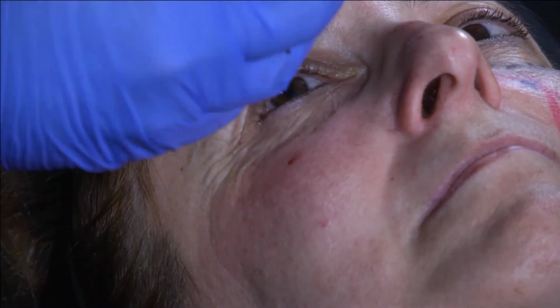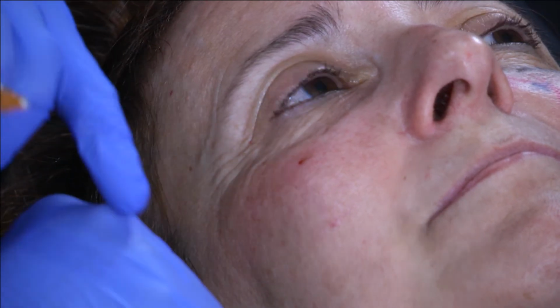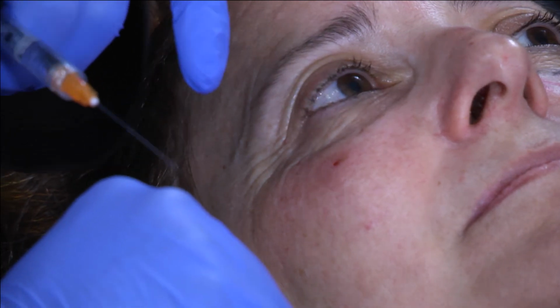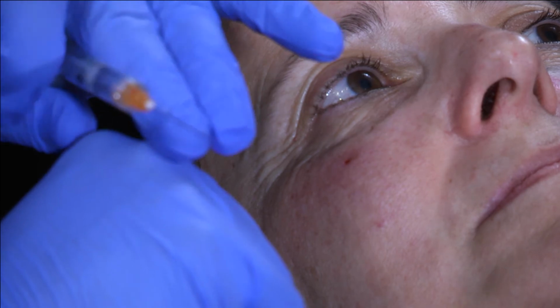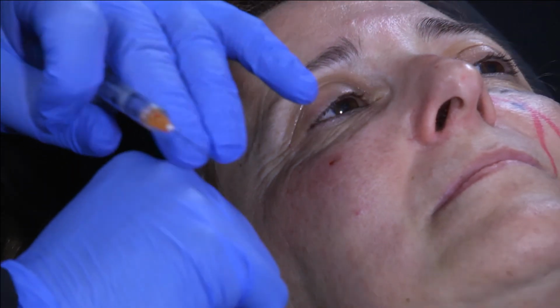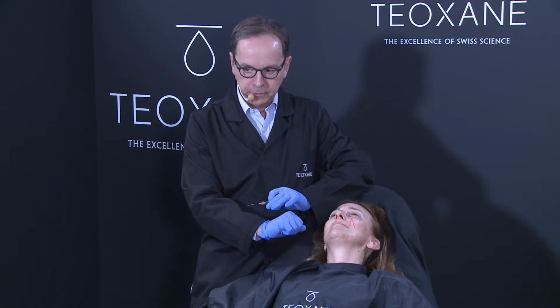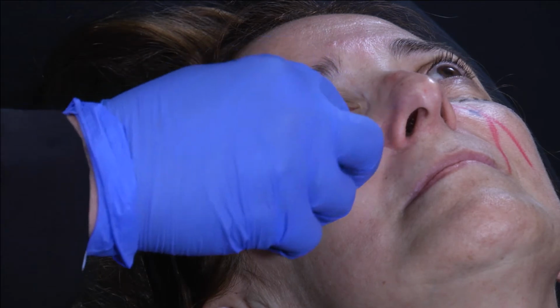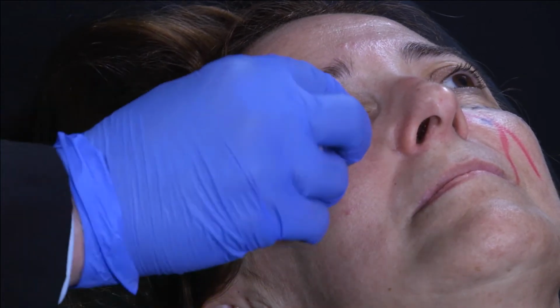The bone, if you are looking at my hand, it's like my hand here. If I put my product just at the top of the bone, and after I do a strong massage in the tear trough, my Redensity 2 will move up and down. So for each injection in the tear trough I do, I never ask my patient to do a massage.